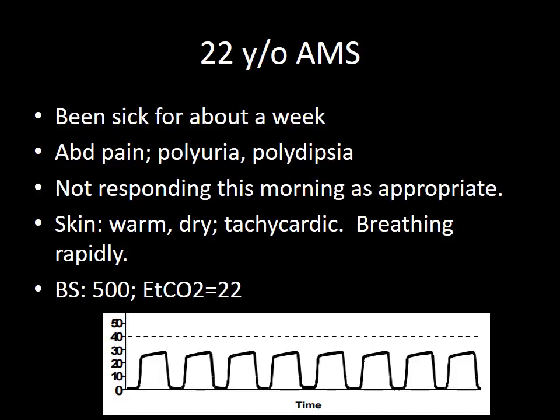So one thing to remember, shallow boxes do not mean shallow breathing. It's the opposite. Shallow boxes means she's breathing fast and deep. At least she's breathing deeply for the shallow boxes, and we see them in quick succession, so she's breathing rapidly. And this has a name where they are breathing fast and deep, and that's Kussmaul, and we see that with DKA. And that fits that clinical picture as well.